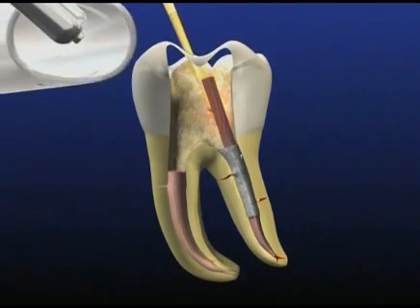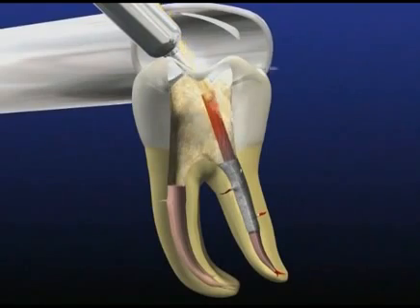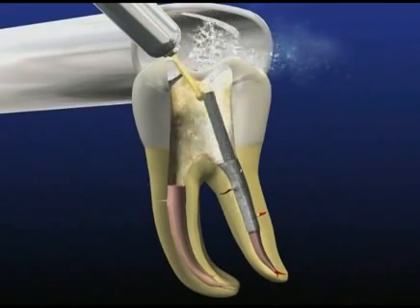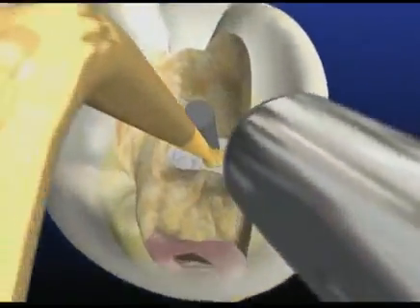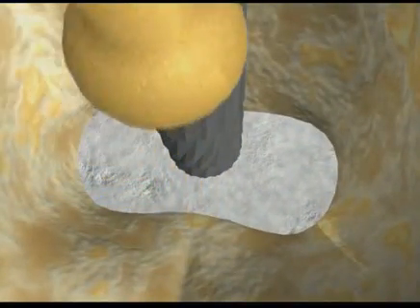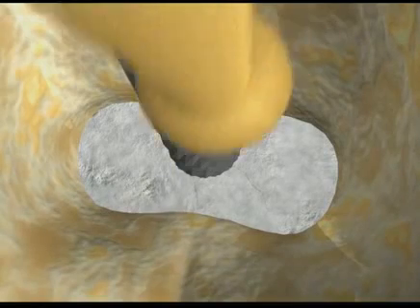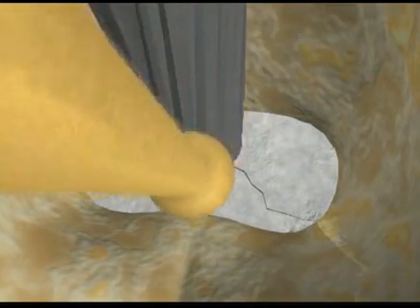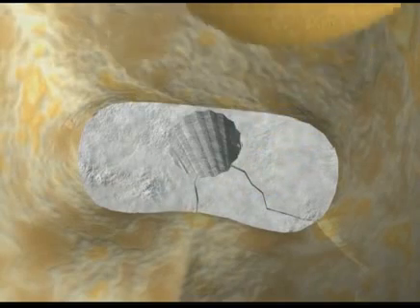However, ultrasonic procedures generate heat, particularly when removing large conductive metal posts. Therefore, use an external water source to reduce temperature and eliminate heat transfer. We are now looking at the occlusal view. The energized Endo 1 tip continues to vibrate against the post. We can now observe fracture lines in the cement and the initiation of post bond failure.